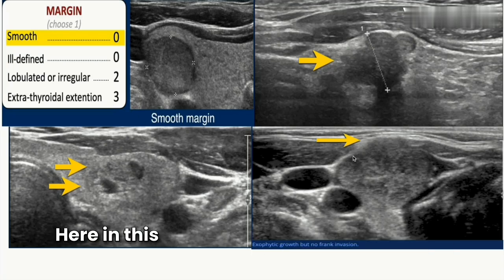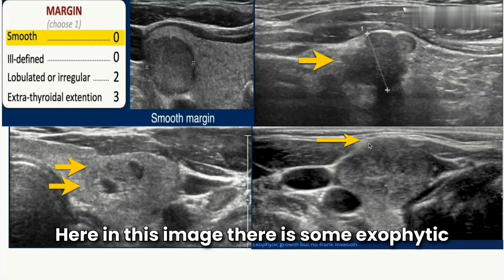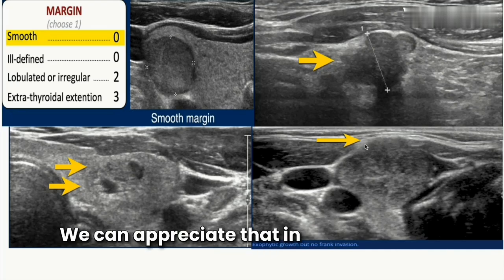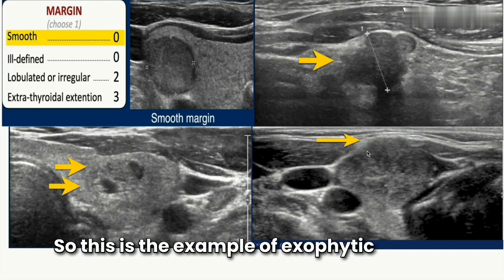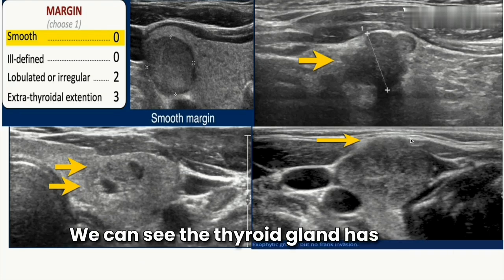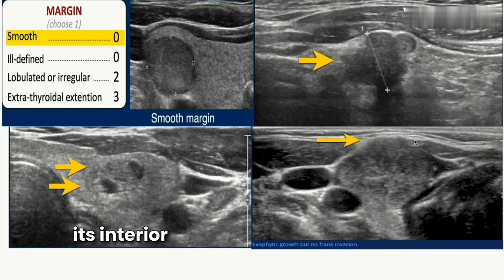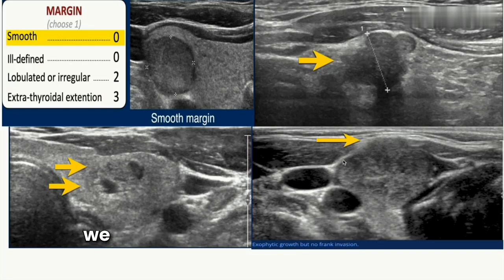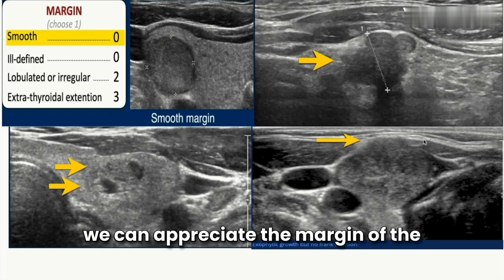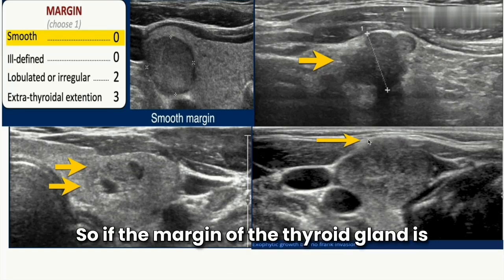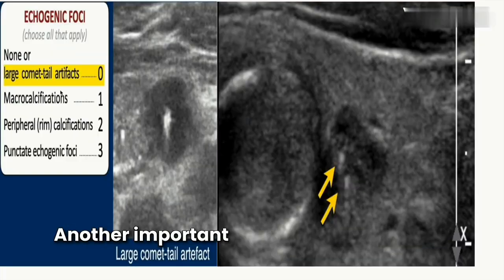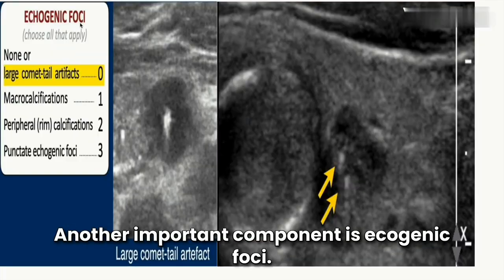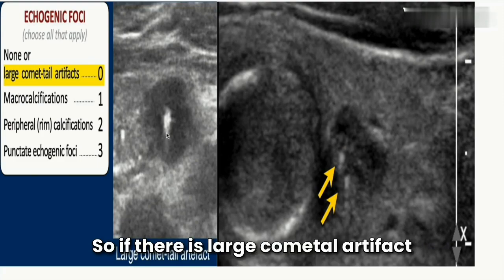If the thyroid lesion has extra-thyroidal extension, we give three points. In this image there is some exophytic growth, but we can clearly appreciate the thyroid margin, so this is an example of exophytic growth without frank invasion. Only if the margin of the thyroid gland is poorly visualized do we give three points for extra-thyroidal extension.